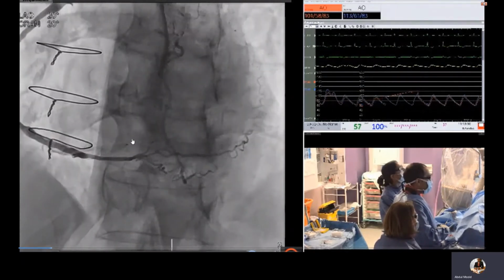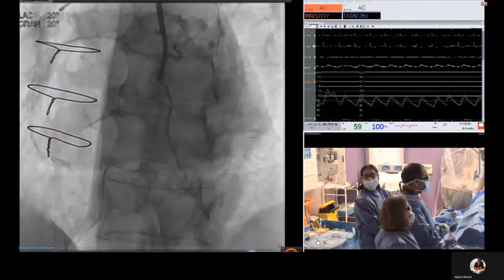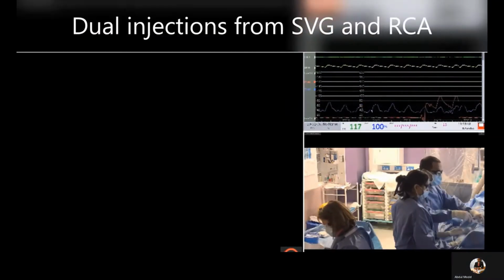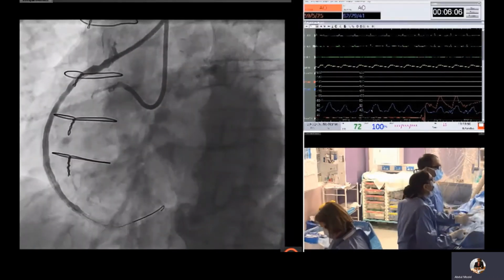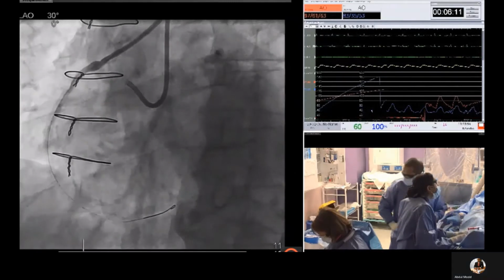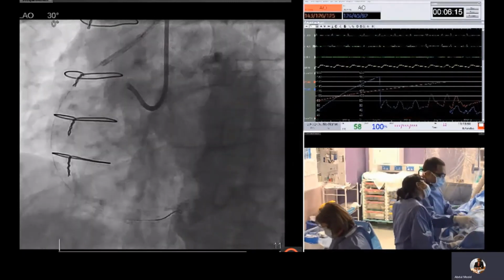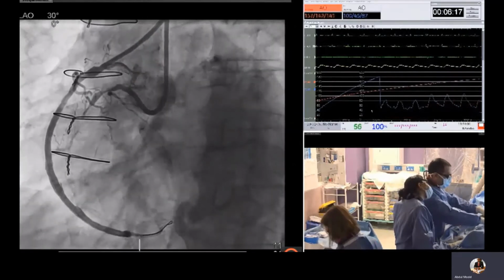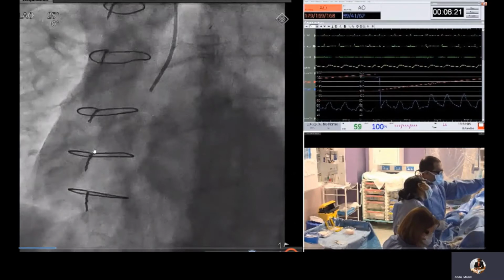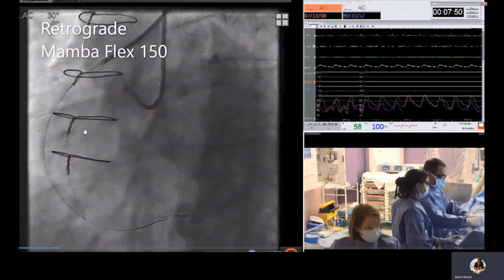The right coronary artery is heavily calcified throughout its course, as you can see here. So this is dual injections from the graft and the native right coronary artery. This was a multi-purpose guide catheter from the left radial and an AL1 guide catheter from the right radial. And you can see heavily calcified right coronary artery with a short occlusion in the mid vessel.